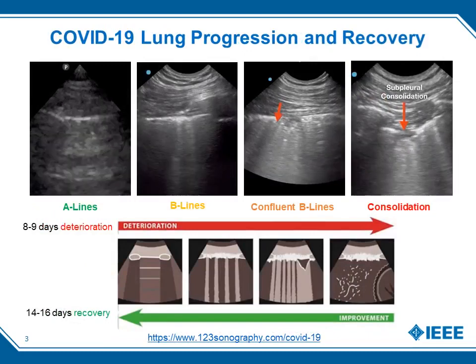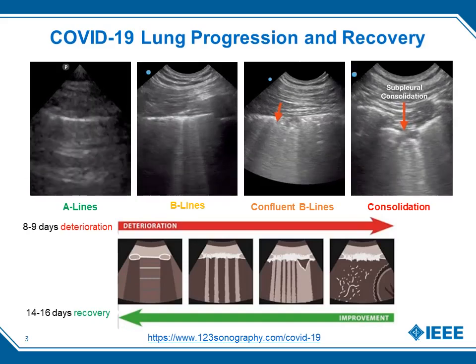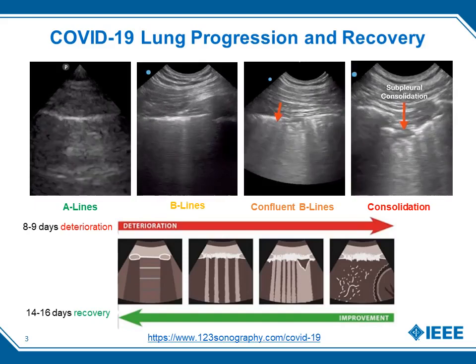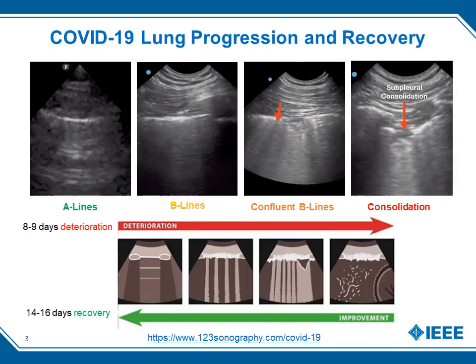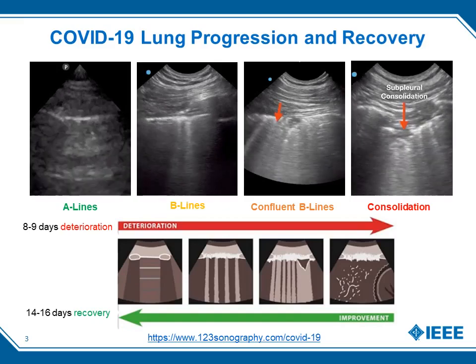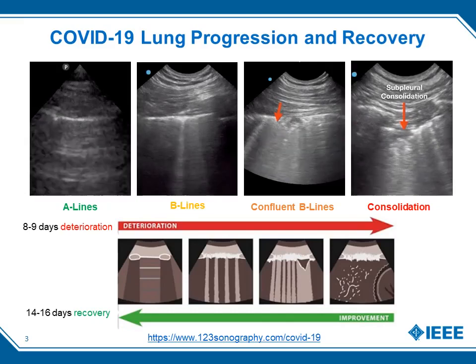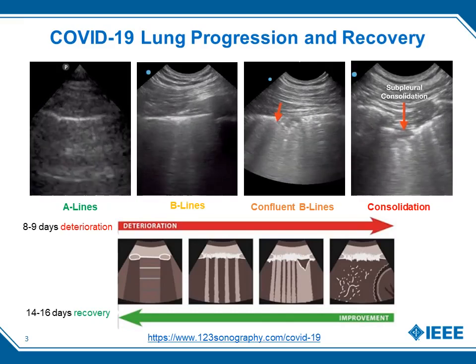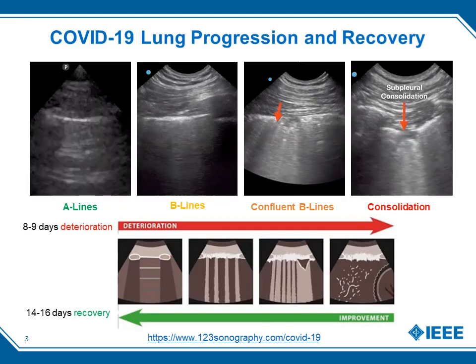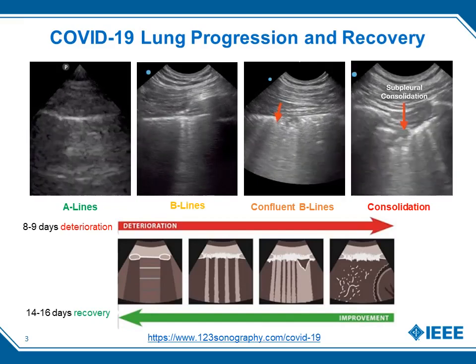One caveat regarding ultrasound findings: they are not specific. B-lines and pleural effusions can show up in a variety of diseases, including congestive heart failure, pulmonary edema, fibrosis, atelectasis, pulmonary contusion, and a host of viral pneumonias, including influenza, RSV, adenovirus, rhinovirus, and parainfluenza. That being said, this slide lists some normal and abnormal findings associated with COVID.